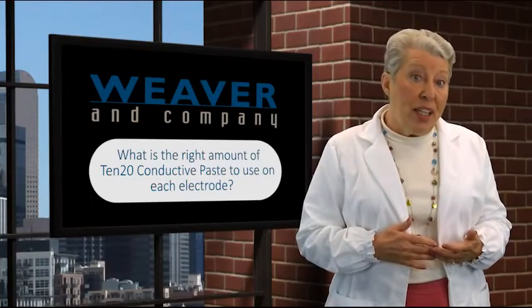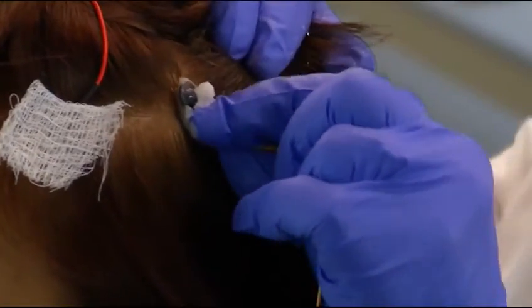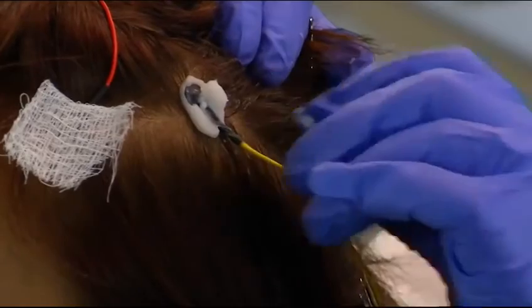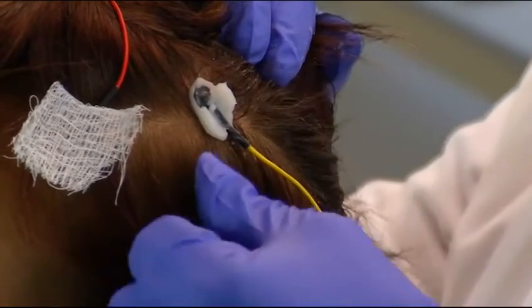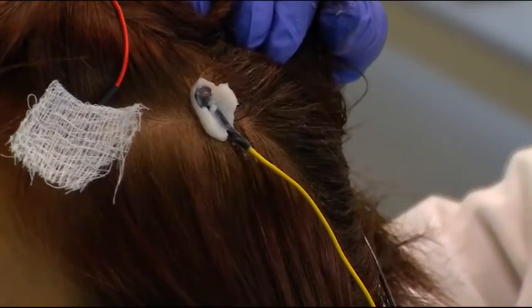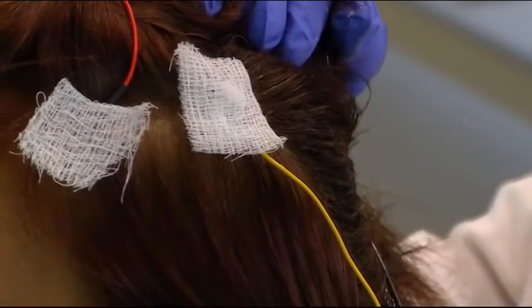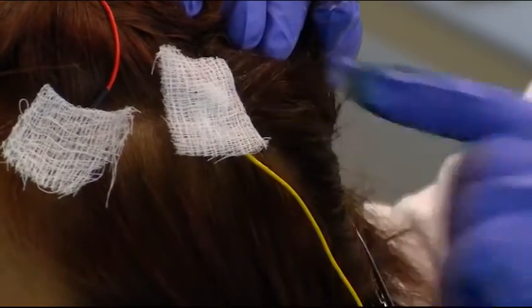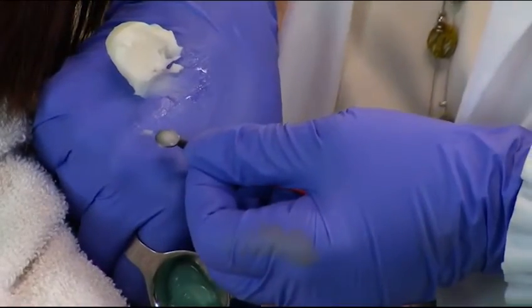Using too much 10-20 conductive paste can cause problems. Here's an example. If you use too much 10-20 paste and overfill the cup, you'll spread the paste in a large diameter. The 10-20 paste that spreads out acts as if it were the edge of the electrode, especially when you press the gauze onto it. This makes the inner electrode space smaller and can cause the EEG to appear asymmetrical. So use only the amount of 10-20 paste that fills the cup.